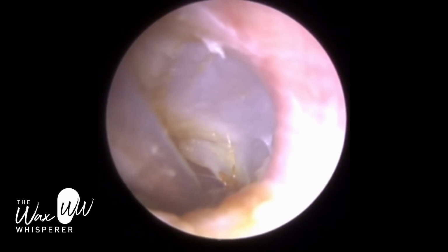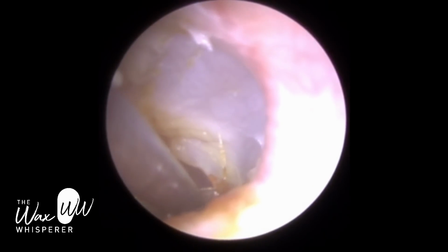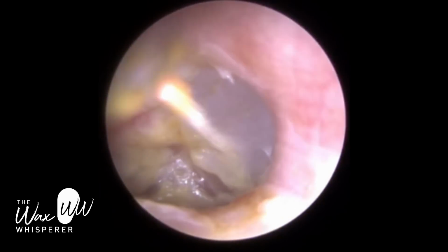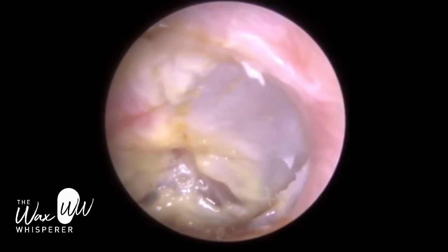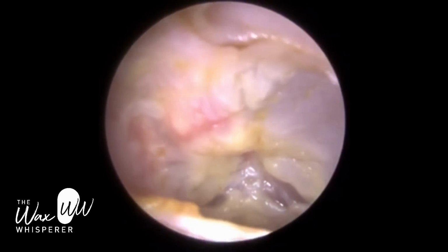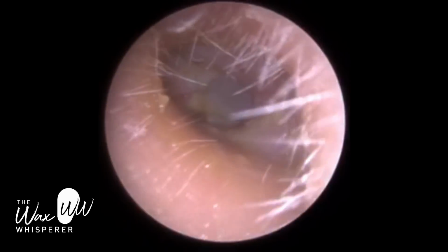Similarly, if you get water in your ears, water can settle in this ridge, both in the inferior recess or the anterior recess, and affect your hearing. It's so difficult to get access. Now with an endoscope we can visualize inside that recess. With an otoscope or microscope you may not be able to, but I'm very pleased with that. So I can see the whole eardrum. The rest of the dead skin will naturally now shed.